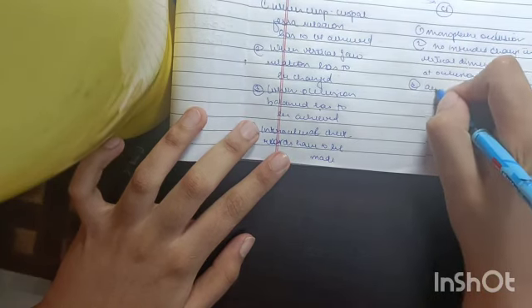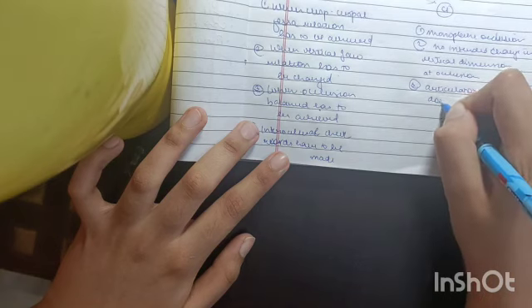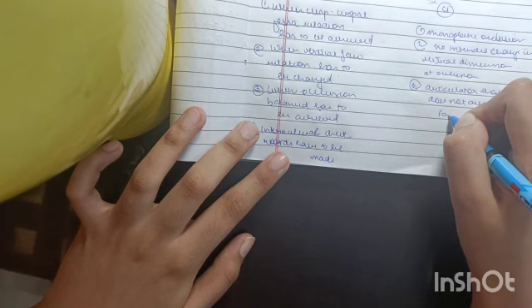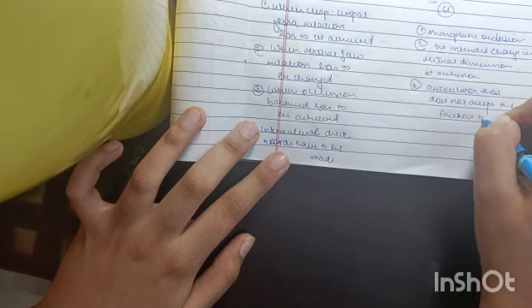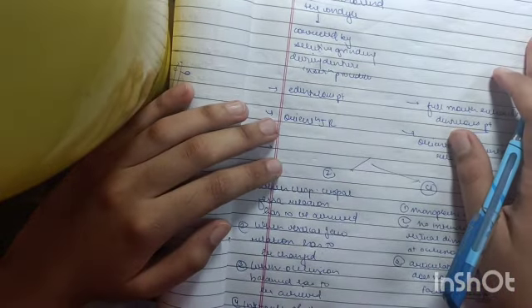Third is when we have an articulator that does not accept the face bow transfer. Now, face bow transfer is mainly accepted by class 3 and class 4 type of articulators. So, this is the basic difference between the types.